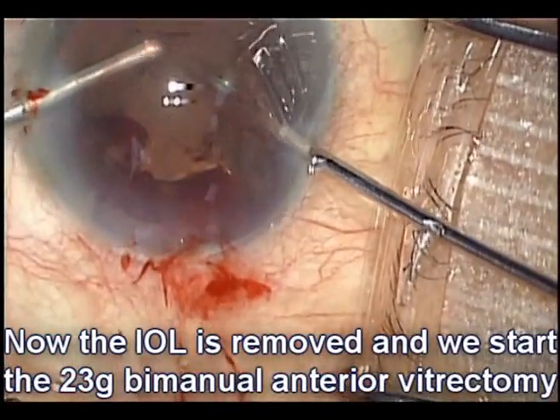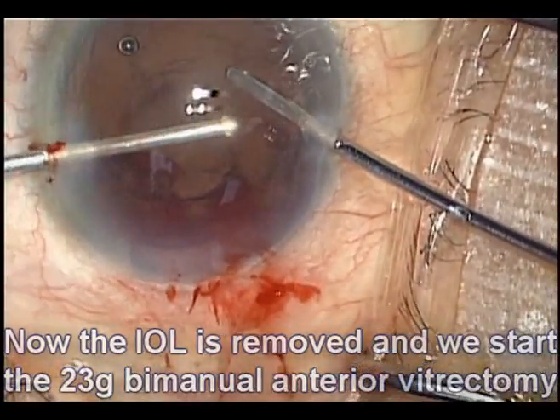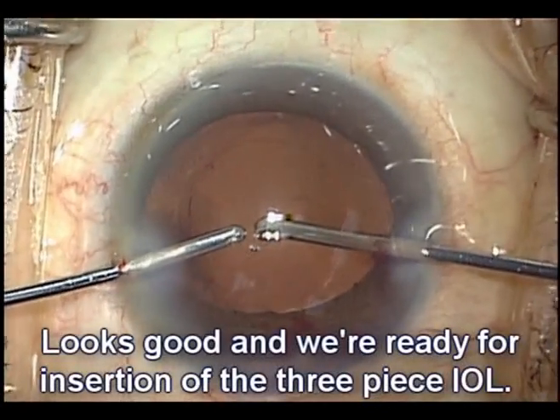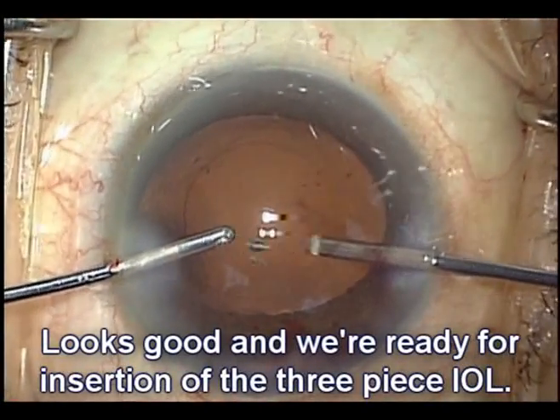Taking our time, we'll do a 23-gauge bimanual anterior vitrectomy. This is to remove any prolapsed vitreous, as well as to clean up any of the bleeding.